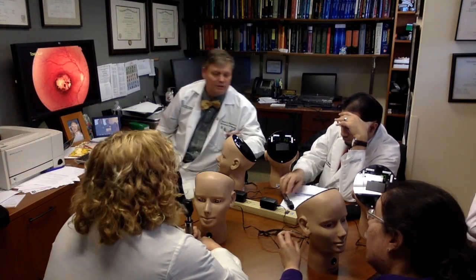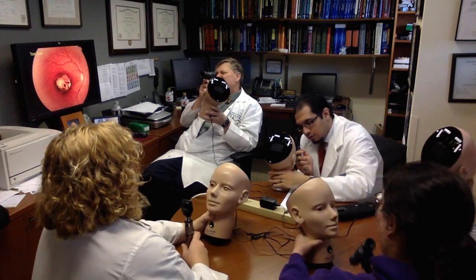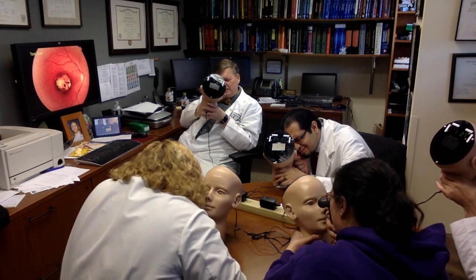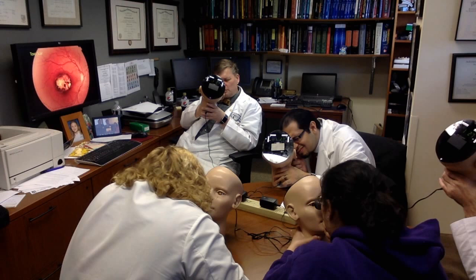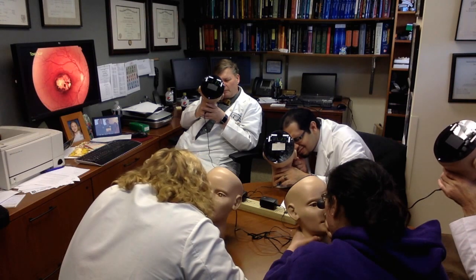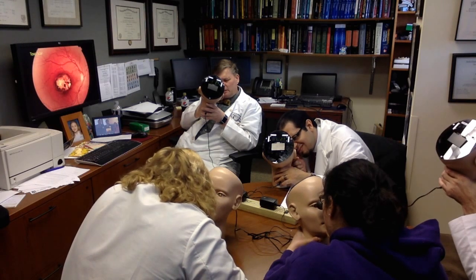Okay, let's look at number 27. Now, this is going to be a blow-up view. So let's look at a distance. Come in closer, closer, closer, closer, and then let's focus and ask yourself, do you see a big blue-gray blob? But off to the left of the blue-gray blob, do you see the retina? Okay, now the blue-gray blob, do you agree it's relatively demarcated?